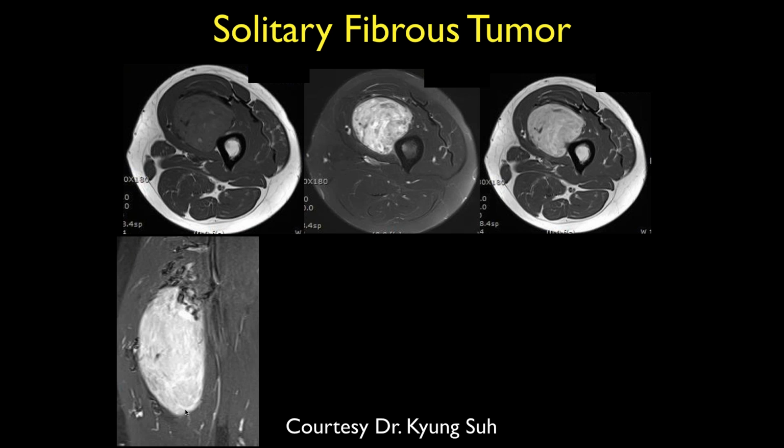Okay, it's a fibrous area again. Sort of a fibrous tumor. Okay. So, Dr. Cruz, homogeneous for this? Yes. All right. You said it's like a fibrous tumor, but on this one, it doesn't look so fibrotic. It is not as low signal as you would expect.